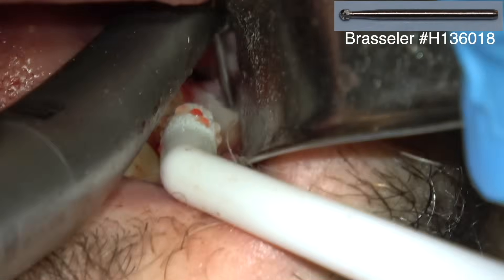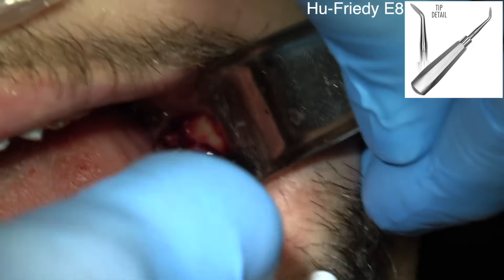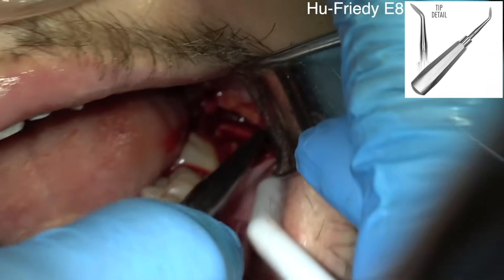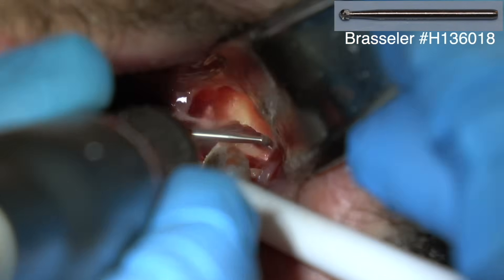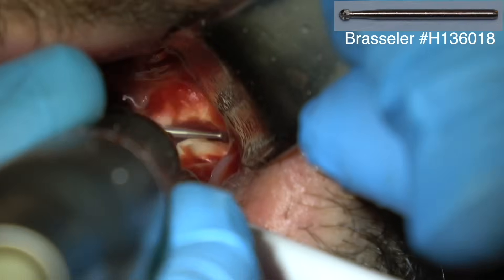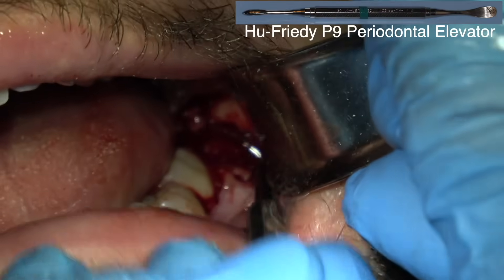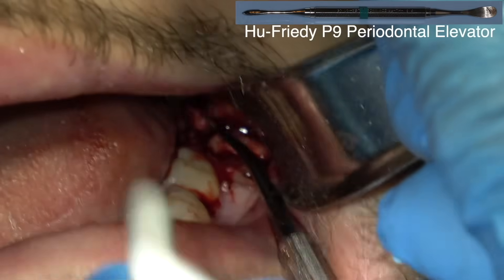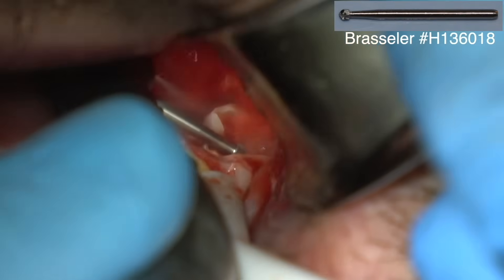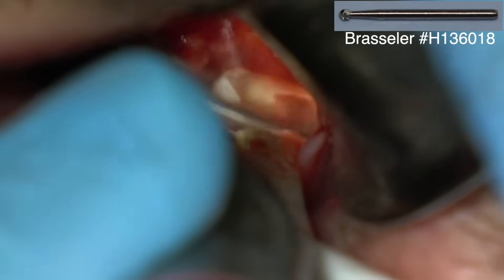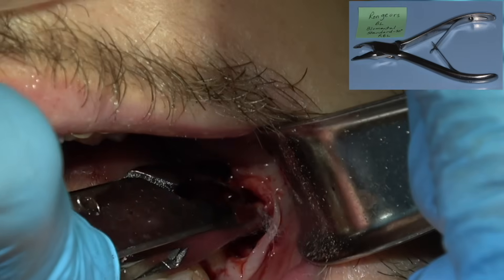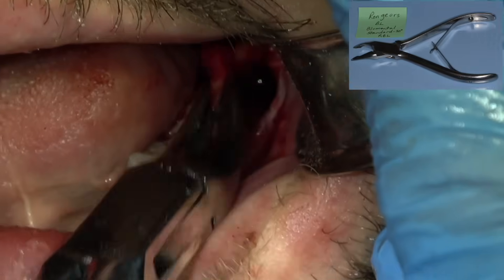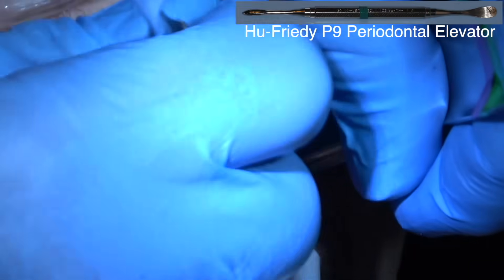So there's the distal — here's the distal piece. I'm trying to move that up but it's hitting the distal part of the socket. So I'm creating a little more space in the section and then cutting the distal part of the distal crown off so I can elevate it and it doesn't hit the back of the socket. So there's the distal root and the distal part of the crown — I've sectioned through to the furcation. It's moving. You can't get in a hurry. The harder it gets, the slower I go, because I don't want to fracture the root. I want the piece to come out in toto if I can. So there's that distal root and the distal part of the crown.